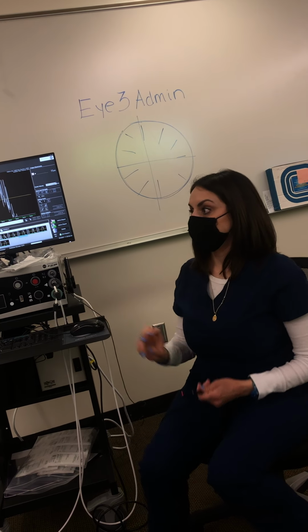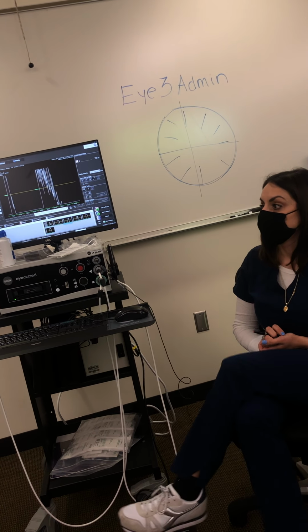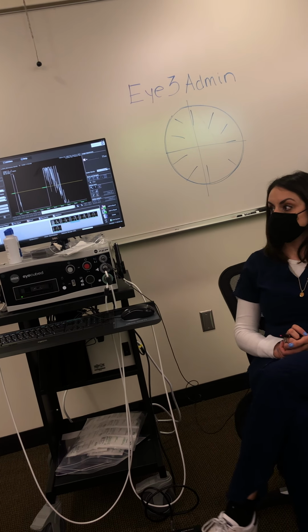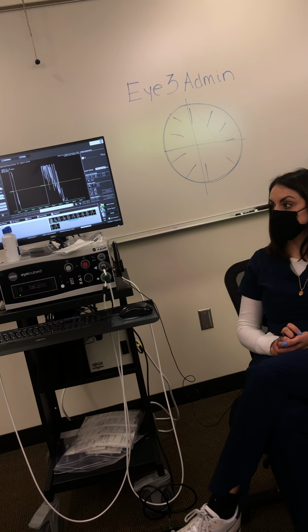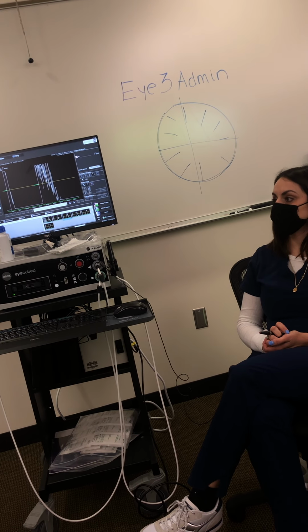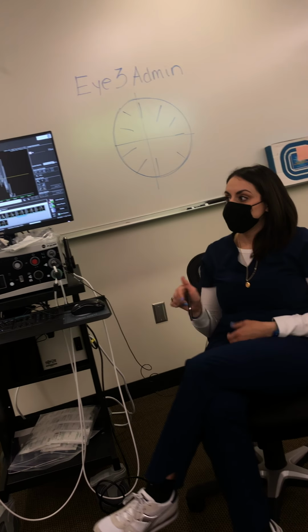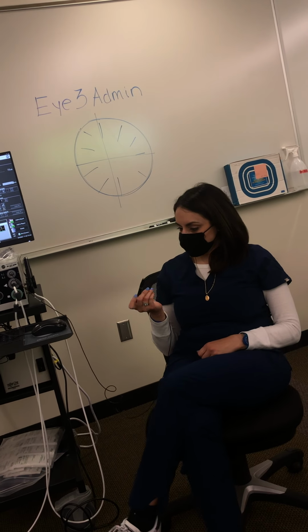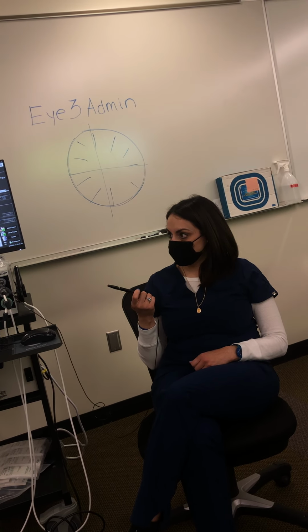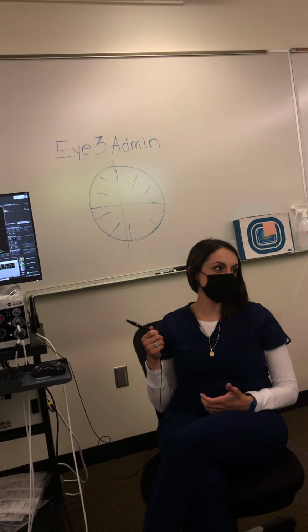I don't remember if I mentioned this to you guys, I was fixating on a distance target. When the probe came in and I was fixating on the red light, it was literally almost my entire field of vision. So that doesn't work very well, like you were saying. And I think I use the red light more as a guide to let me know that the probe is on and working than as a fixation light.